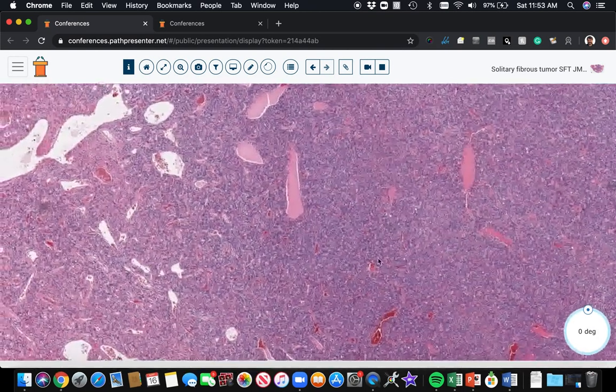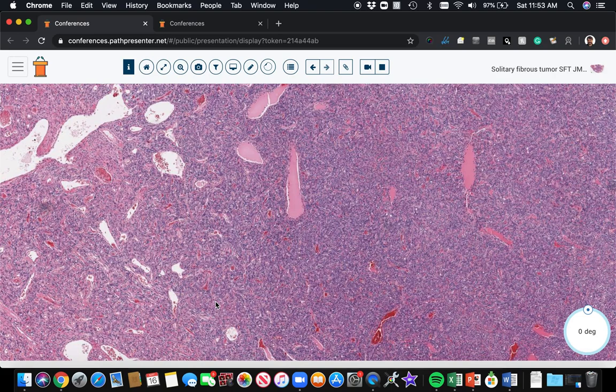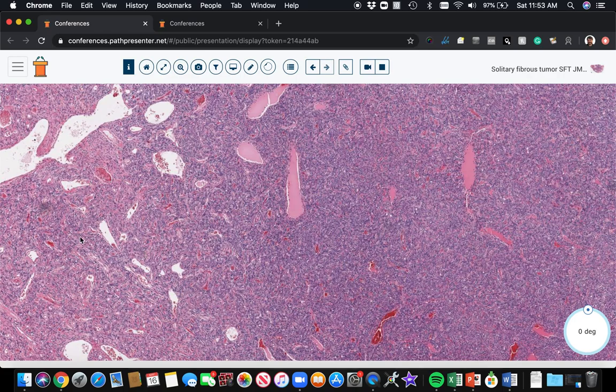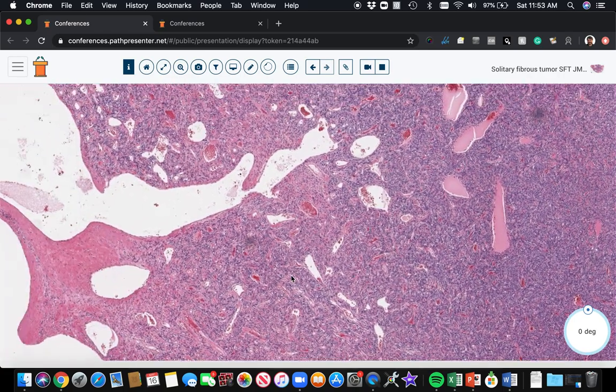Solitary fibrous tumor is classically positive for CD34. And I will point out to you that CD34 is positive in many different fibroblastic tumors. So it is not a specific marker. You have to use it with a great deal of caution. It can be very helpful because it's a very sensitive marker for some things, but it's not specific. It can be seen in DFSP and solitary fibrous tumor and spindle cell lipoma and on and on and on. And also in vascular tumors too. So it's useful in certain contexts, but CD34 is relatively nonspecific.